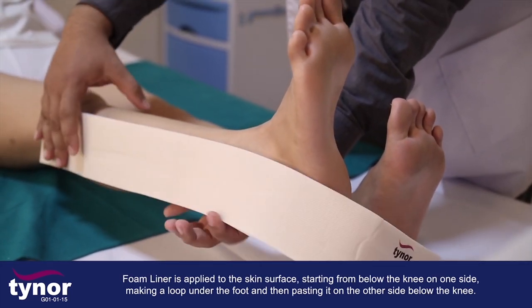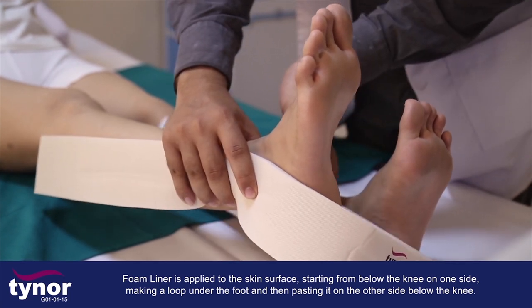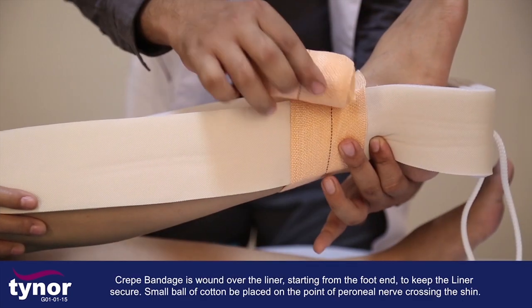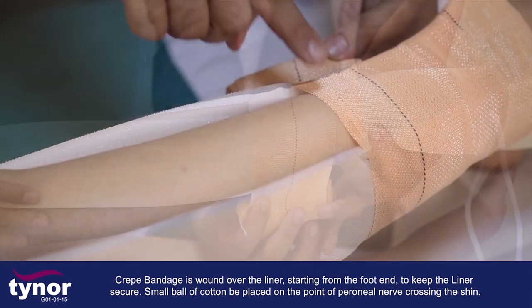The foam liner is applied to the skin surface starting from below the knee on one side, making a loop under the foot, and then pasting it on the other side below the knee. Crepe bandages are wound over the liner starting from the front end to keep the liner secure.